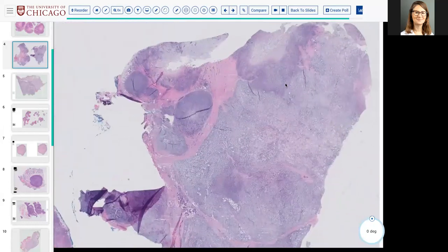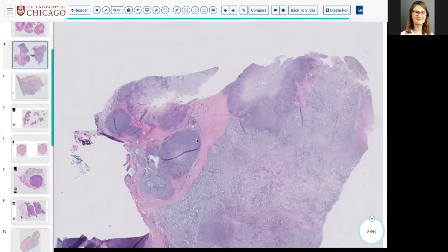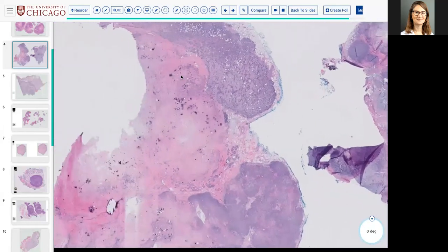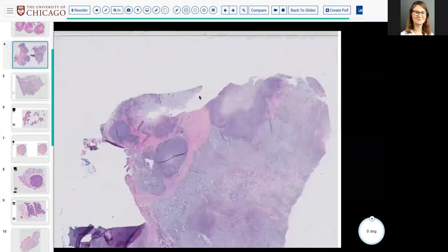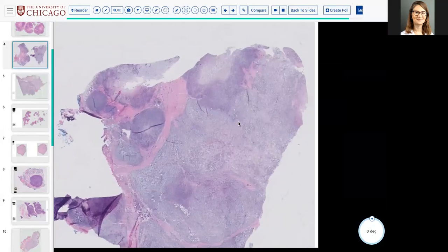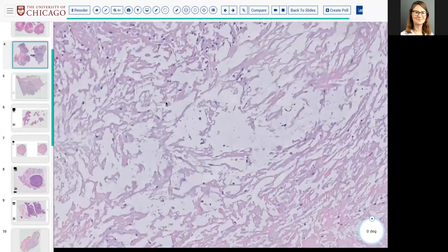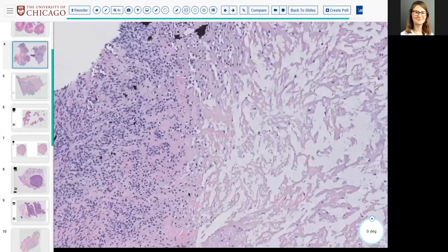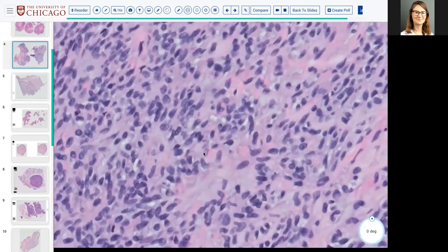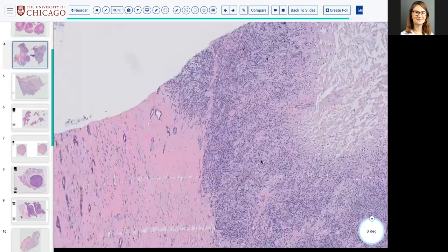I don't remember ever finding any true ducts in this case, so we called it myoep. But the thing that is similar about both myoep and epimyoep, whether they arise from a PA or not, is the fact that they tend to have these large zones of very cellular tumor that are almost lobulated. And then in the center of these lobulated zones is sometimes a degenerative or even necrotic area. So even though these are not always extraordinarily high grade cytomorphologically, I don't see tons of pleomorphism or mitoses, these can actually behave very aggressively.